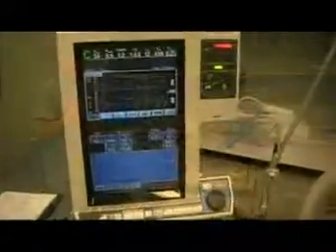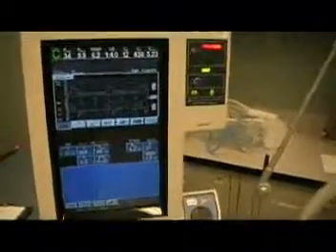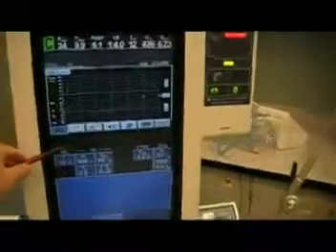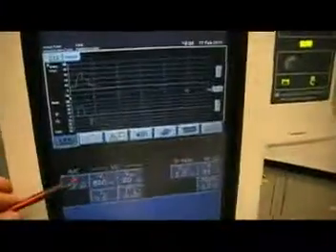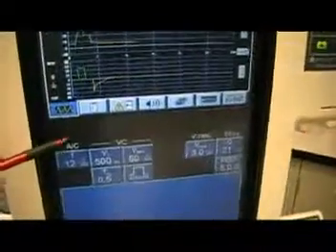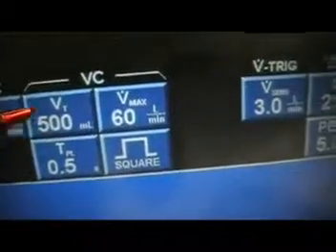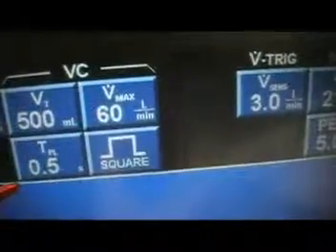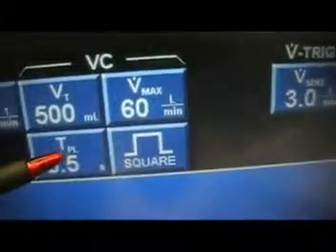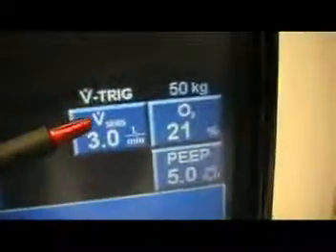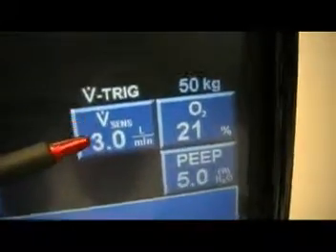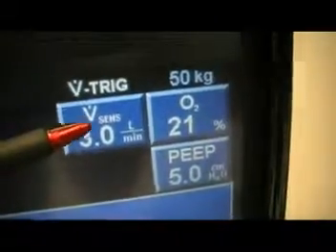Let's look at the waveforms. We've got our basic mode set up on the ventilator — the mode of assist control or volume ventilation CMV. We've got our controls set here: here's our rate, here's our tidal volume, our flow rate. We've got a short inspiratory pause, we're on the square waveform, we've got the flow trigger set, an FiO2, and our PEEP.